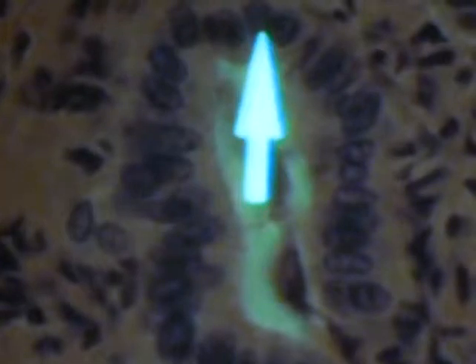For the bile duct, you're looking for a simple cuboidal epithelium. So notice we have these cells here, our simple cuboidal epithelium. That would be the bile duct. But to classify the structure as the portal triad, you want to see all 3 structures sitting beside each other. So we're not really seeing the vein here. We found the artery, we found the bile duct. Let's see if we can find another one that has all 3.